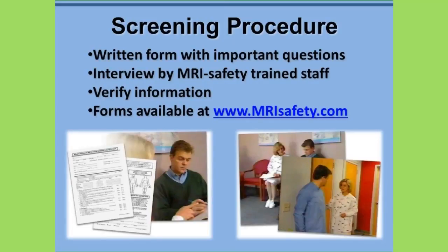During the interview, the information on the screening form should be reviewed to verify that there are no factors present that would pose a hazard. By requiring the completion of the screening form and interviewing the patients and individuals to verify the information, the MRI facility will make certain that healthcare conditions or items that may pose safety issues or other problems will not be missed. Therefore, the screening form asks important questions to determine areas of concern that must be addressed prior to allowing entry into the MRI environment.